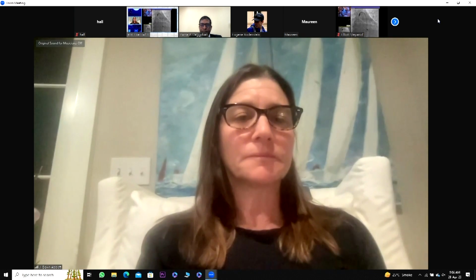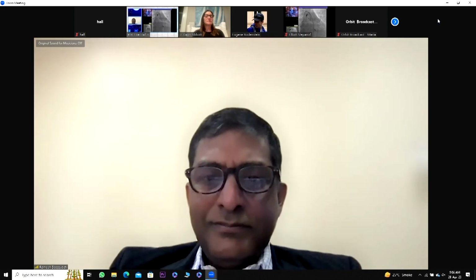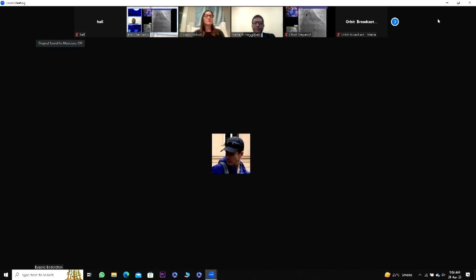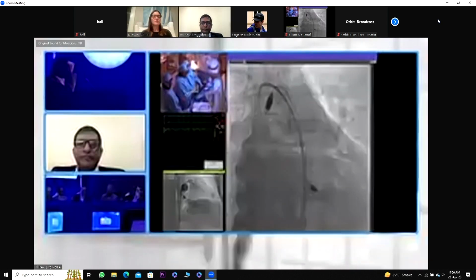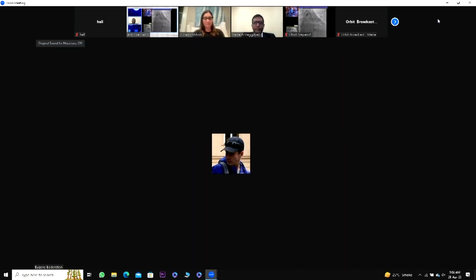Well, Impella was great for this portion, I can tell you. Yeah. So we're just going to go up here, we will pot, and then we will... What is the ACT you are maintaining? With bivalirudin, once it gets over 300, we don't check it again. So what was the ACT in this case?